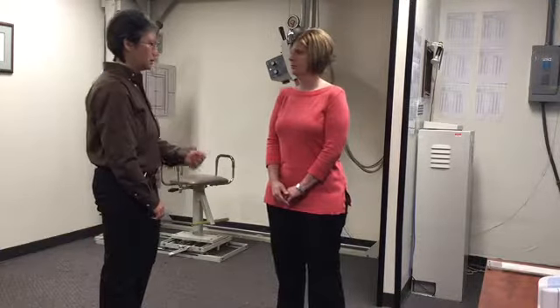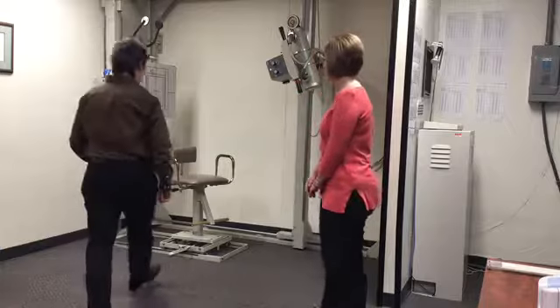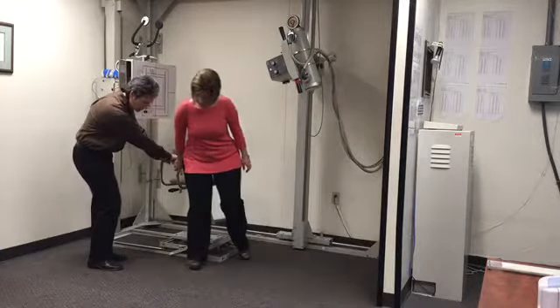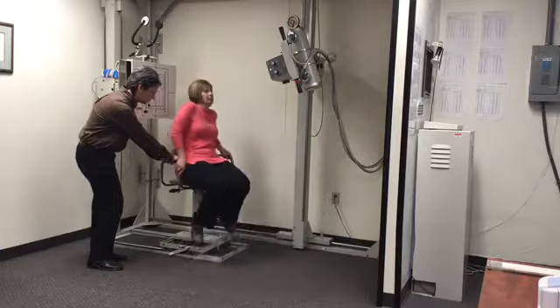This is the positioning of a patient using the 20 steps for an AP lower cervical. Okay, patient's in a gown and stocking feet. All artifacts are removed. Ma'am, we're going to need you to come on over here and have a seat. I'm going to hold the chair while she sits. We're going to make sure the chair is locked before she sits down.